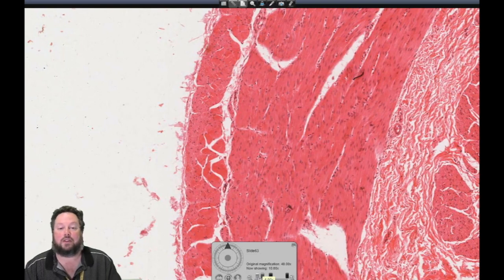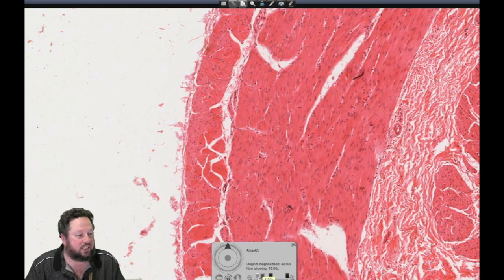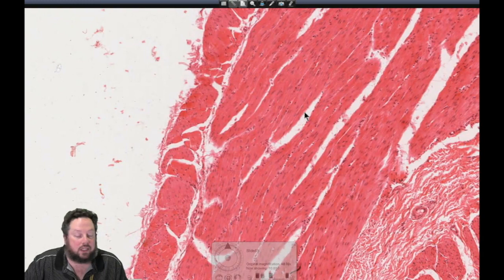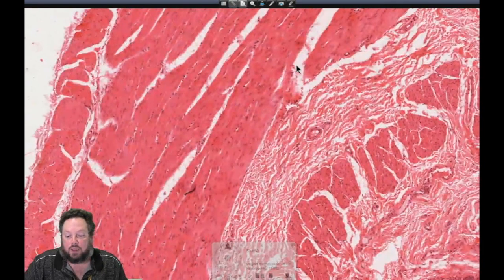Yeah, histologically, right? Absolutely. So James was just saying, if you didn't hear that, it's a really good way to distinguish between the two muscle tissue types by having them so close together, side by side there. Skeletal muscle fibers and smooth muscle fibers side by side. Does anyone have any questions about the esophagus there?